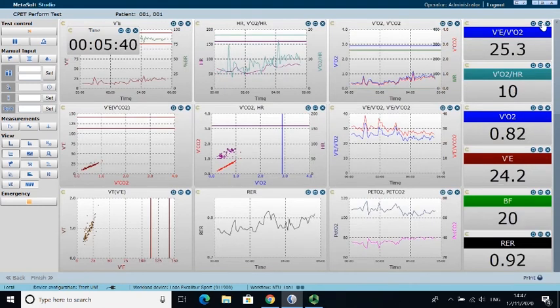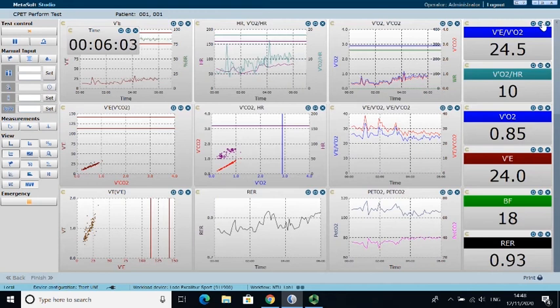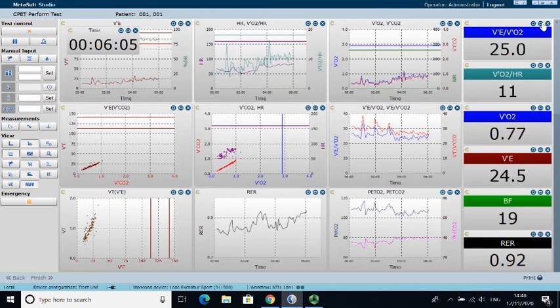Right, and what we can see now is that we're coming towards the 6 minute mark, so I'll be telling Matt, no, now the workload is going to start to increase on the bike. You'll not feel anything for the first 2 or 3 minutes, and then you'll start to feel kind of moderate intensity exercise, and then towards the last 2, maybe 3 minutes, you'll start to feel quite difficult exercise, but it's important you just push through because it's a max test, and so we're interested in your values when you're not able to cycle any longer. And then now he's going to start cycling, he's going to start turning the pedals round.